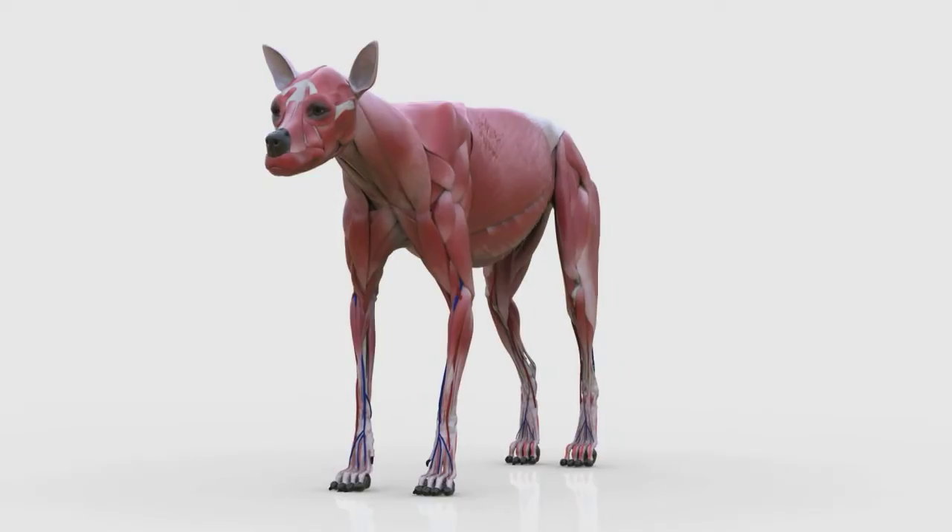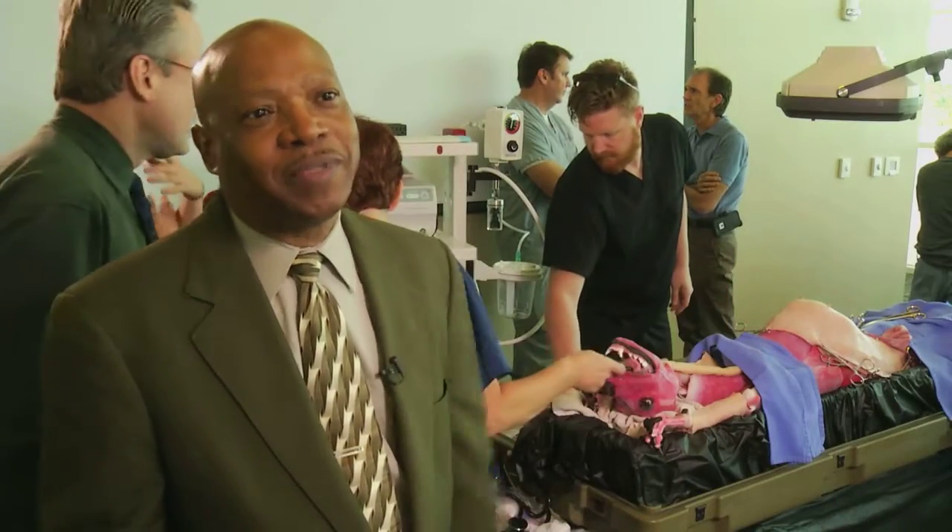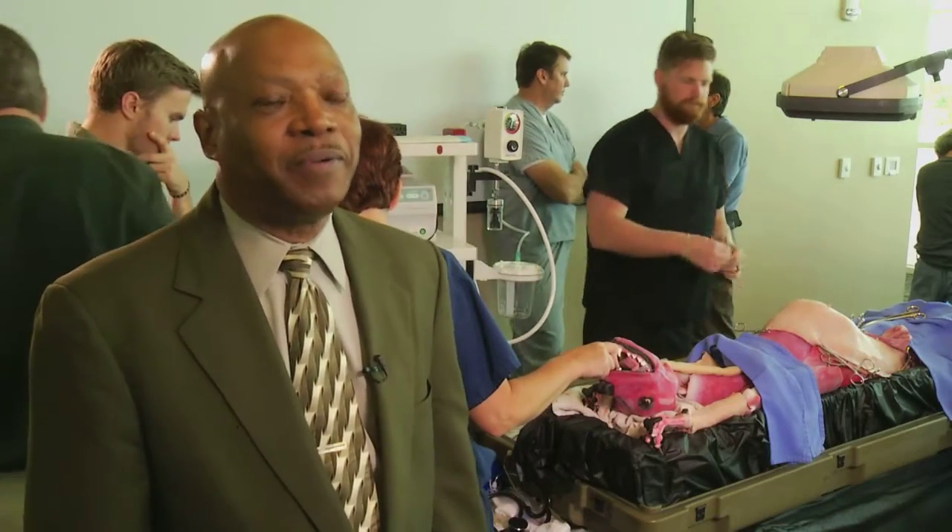I see this type of technology being revolutionary in the fact that it'll replace live animal models. It's hard to go back to cadavers once you've worked with something like this, so I'm very, very impressed.